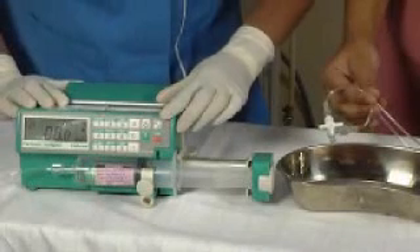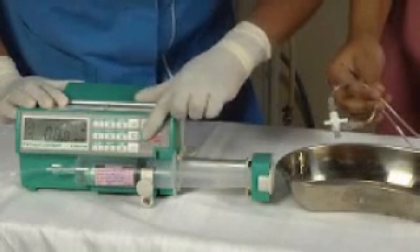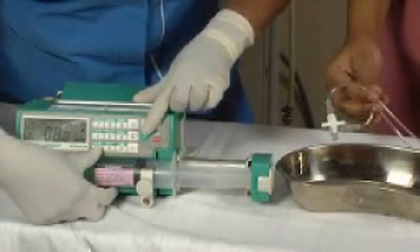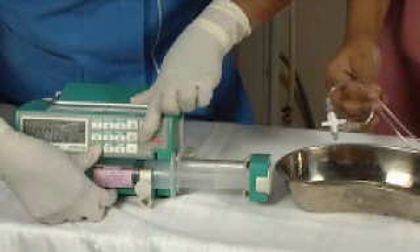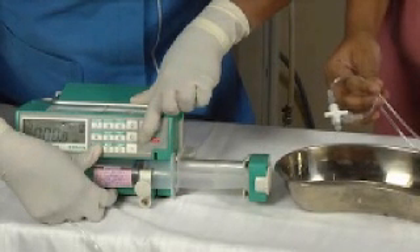To start bolus, we have to press the function and the number one key on the keypad simultaneously. Bolus is given when you need to increase the speed of the dose suddenly without disconnecting the setup.